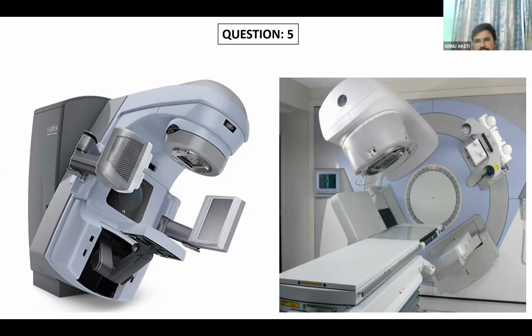No, depleted uranium, someone is asking. No, they are not using any depleted uranium. Planar does not contain any depleted uranium items.